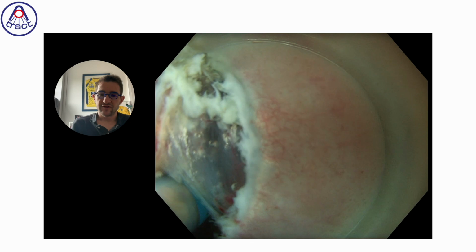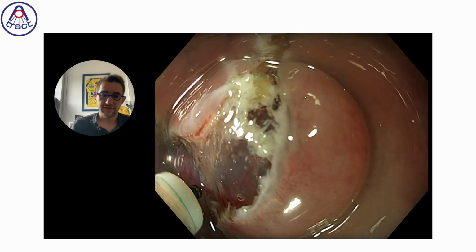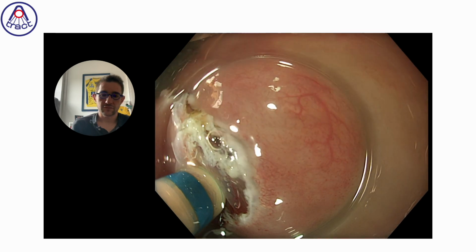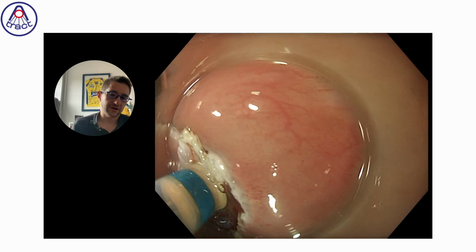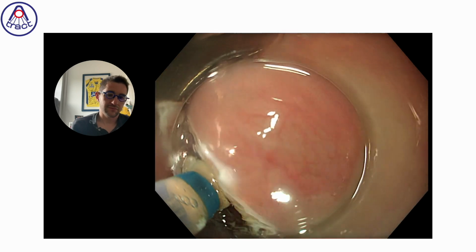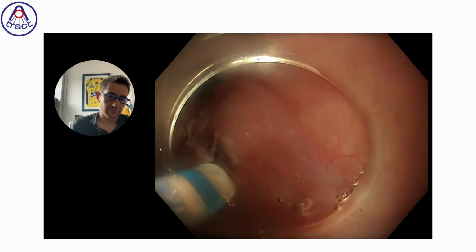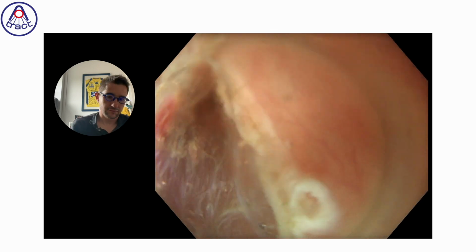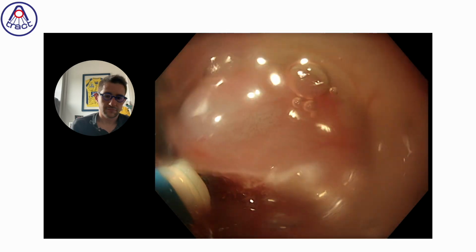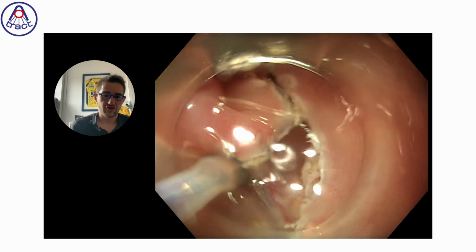So re-injection is important now. We have to cut the two sides of the tunnel in this case. Re-injection, and then trying to go outside. Coagulation of the small vessel.